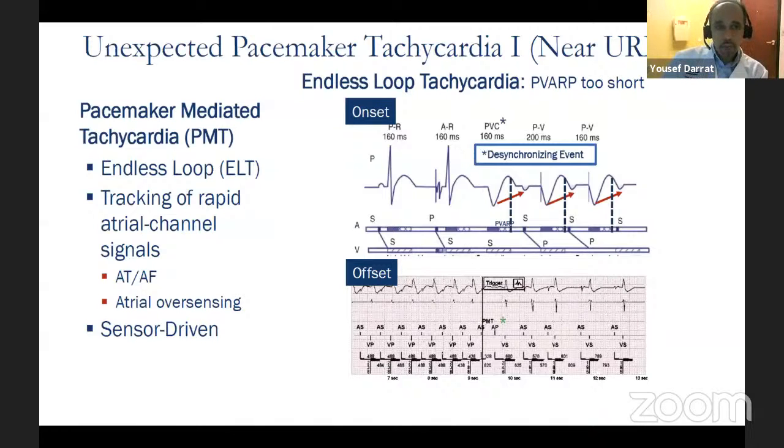So let me, I found the paper. I did share it with everyone. It's in Circulation 2014. And like I said, maybe the example I gave, an anterior wall MI with complete heart block, is an extreme example. Of course, I agree with you that you have to assess the patient, and if you think it's going to recover, obviously you don't need an ICD, but a lot of times you don't know.